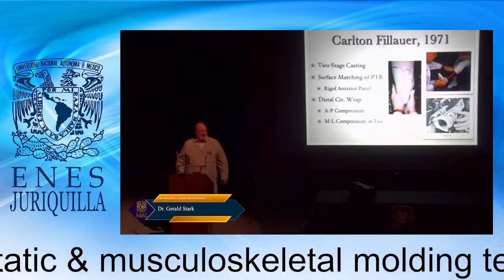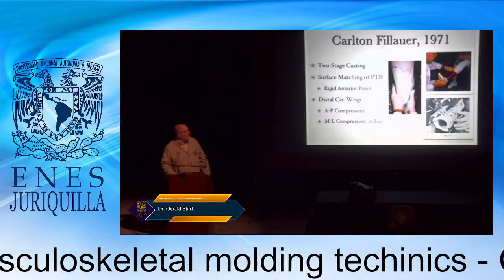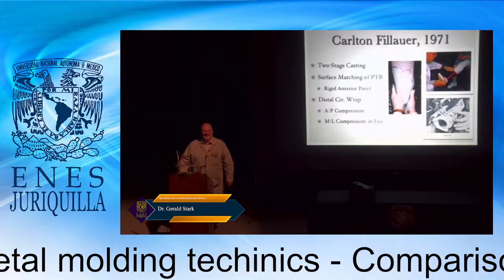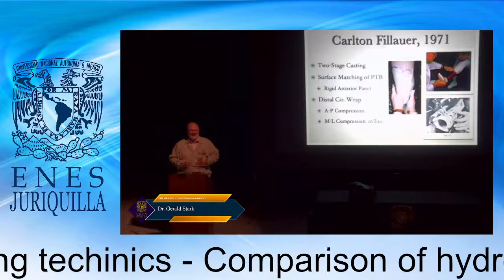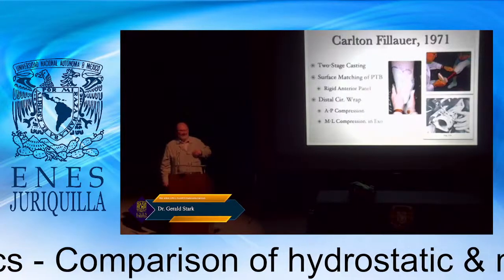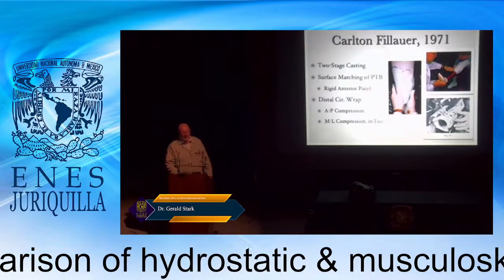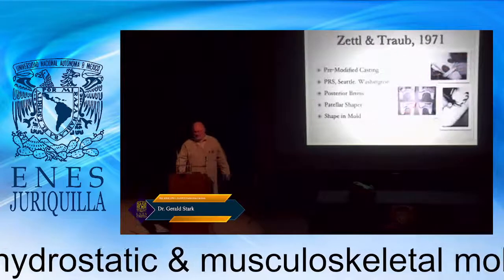This gives you a very characteristic and customized shape, but the downside is it involves a certain level of craft, and it involves a certain level of feel for how much tissue should be compressed. And you can see why engineers have always thought to themselves, why do we have this level of craft? Let's find a formula that can have this work better in terms of pressurization, in terms of air or hydraulics.